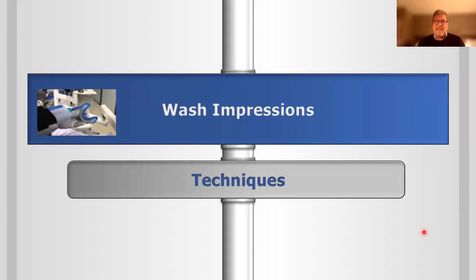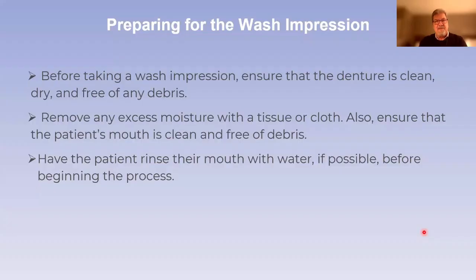So what we're doing is, if the patient has an existing denture, we can take a nice wash impression, scan that wash impression, scan the bite registration, and then send the STL file to the laboratory so they can start on the digital denture. So we're going to talk about some of the techniques that are successful with wash impressions, because I know a lot of practices are having trouble with preparing and taking a wash impression.